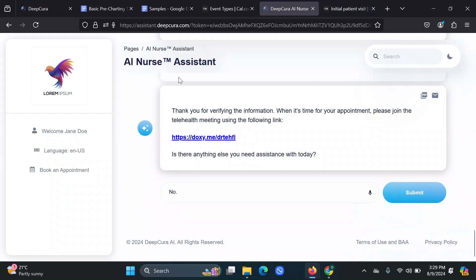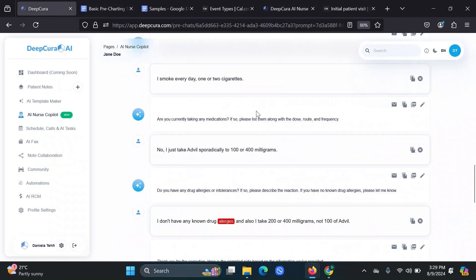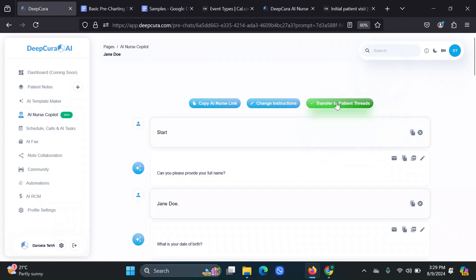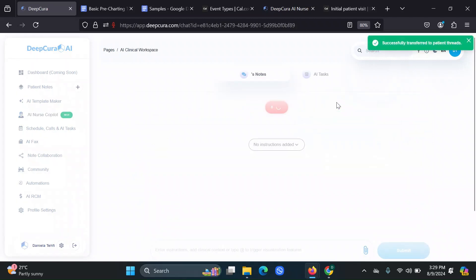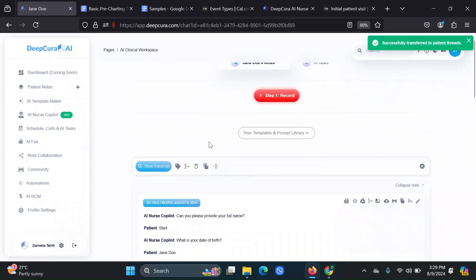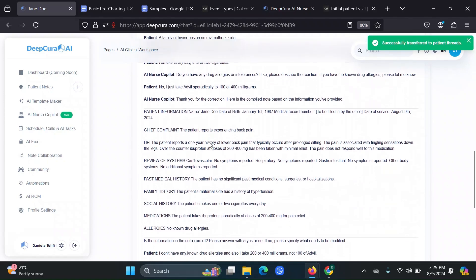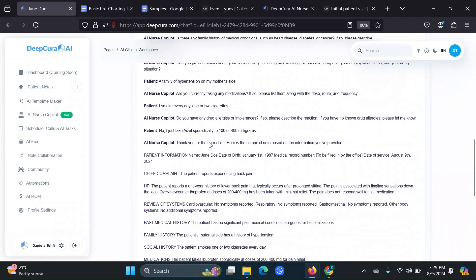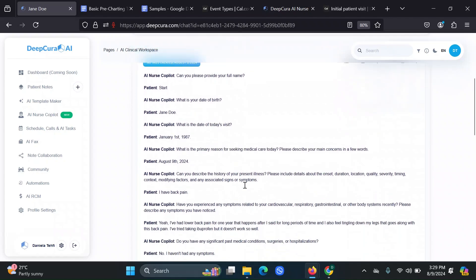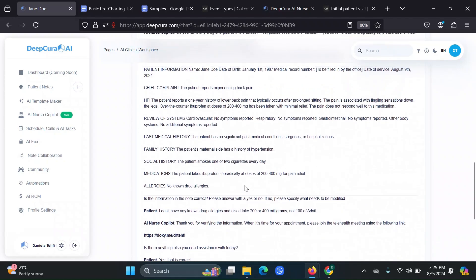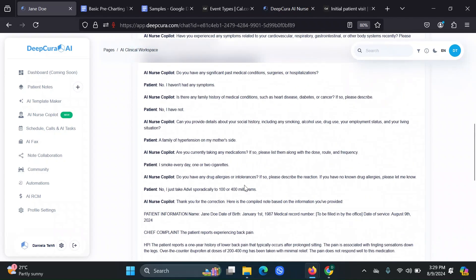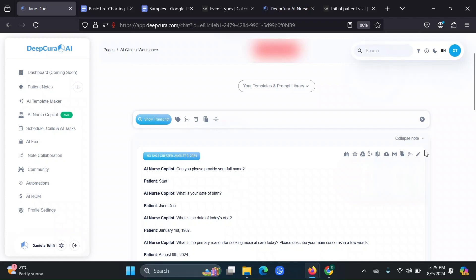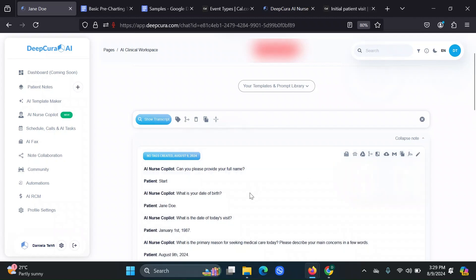So now all I want to do is show you how when you click on transfer to patient threads, it basically transfers as one whole note. Now, you can delete what you don't want. If you would like that, you can also leave it. It's up to you.